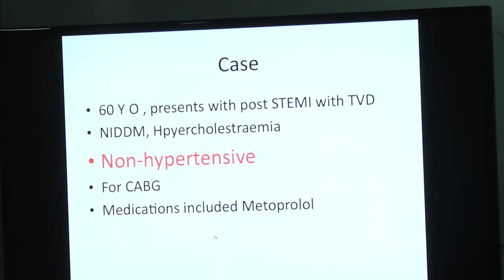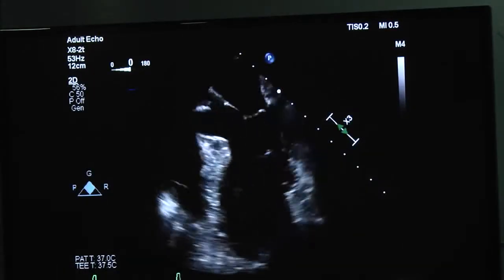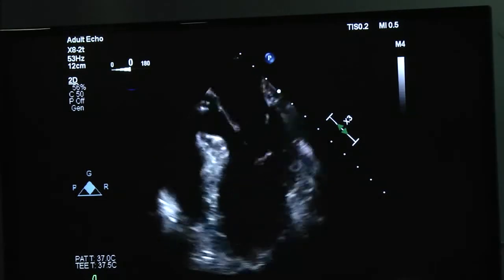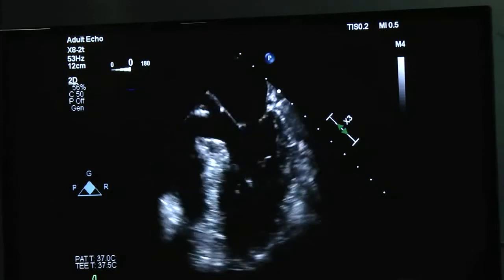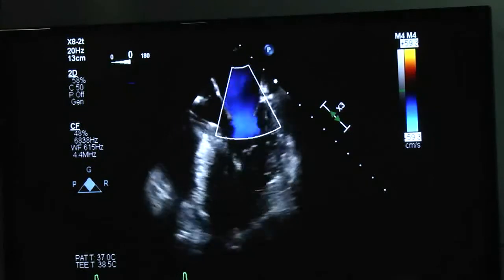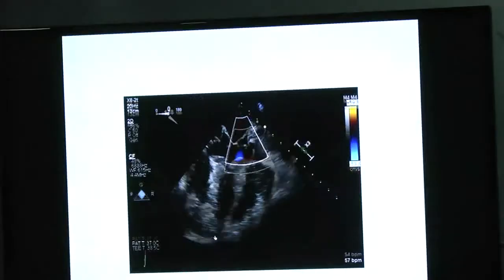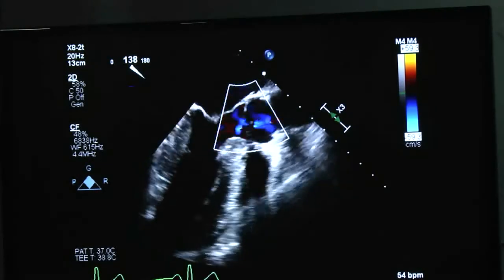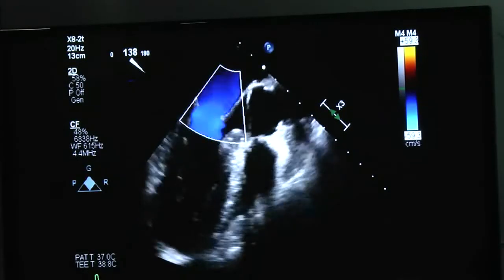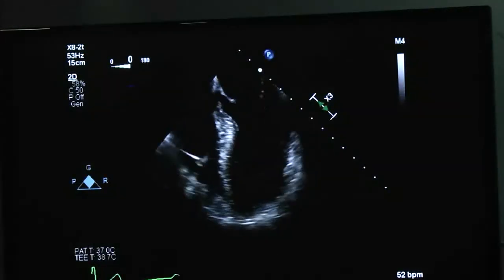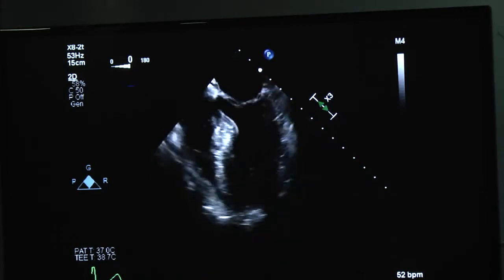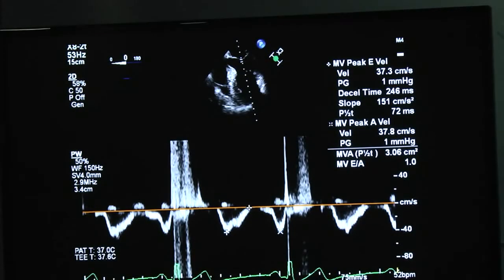Case: A 60-year-old gentleman presented a couple of days before the speaker flew to India — post-STEMI with triple vessel disease, NIDDM, hypercholesterolemia, non-hypertensive, for CABG. Medications included metoprolol. The pre-bypass echo showed asymmetric hypertrophy, nothing around the other walls. You can barely see any mitral regurgitation, no turbulence, no SAM effect at all pre-bypass, and the septal hypertrophy is reinforced.